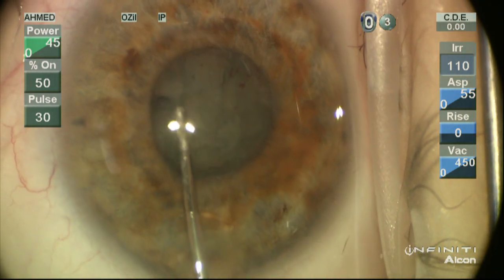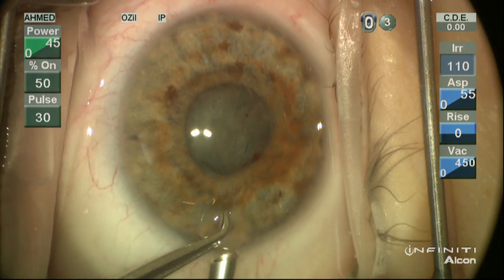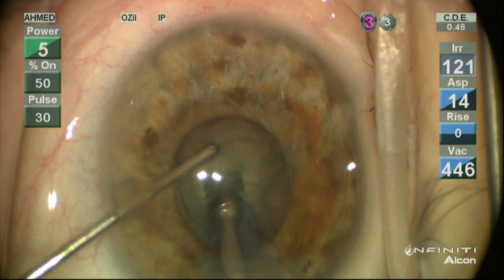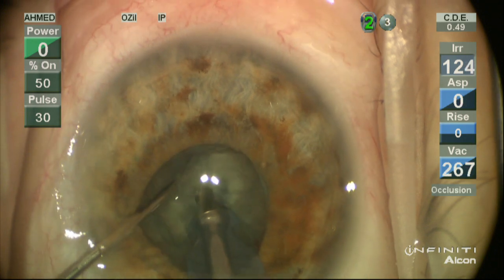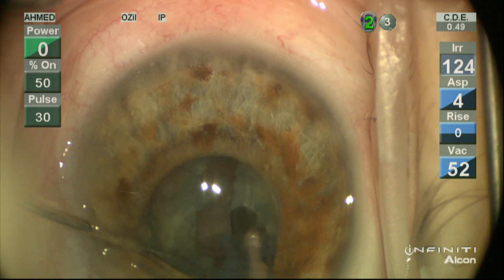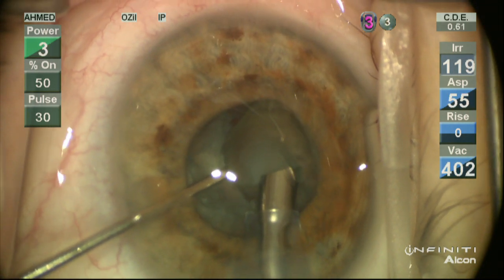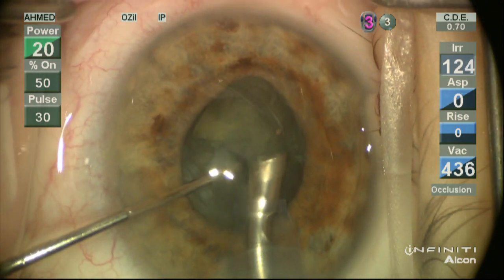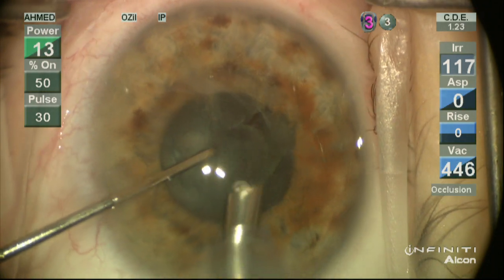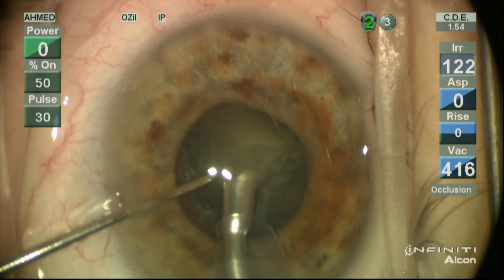We've hydrodissected the lens quite well and we'll do a little rotation to mobilize the lens. We'll enter the eye at position 0, then position 1 once in the anterior chamber to avoid iris prolapse. We're going to use a vertical chop for this moderately dense lens, keeping all instruments within the pupillary space. The back crack ensures we've got a full-thickness crack. We'll then use our classic hemi-flip technique, where each hemi-section after the first chop is turned on its side or flipped halfway beyond the pupil.